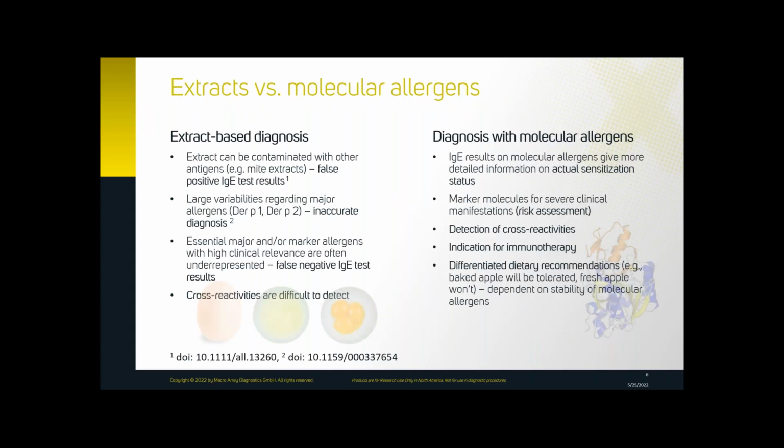So why molecular allergens instead of extracts? Extracts can be contaminated with other antigens, and there are many publications that show that extracts are contaminated with other allergens, leading to false positive IgE results.